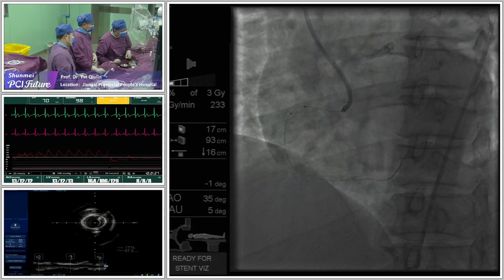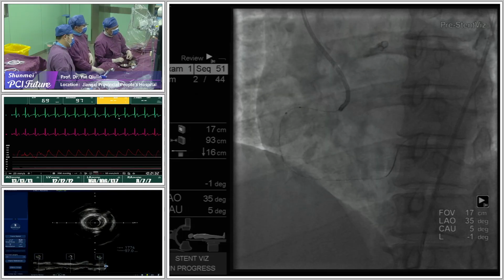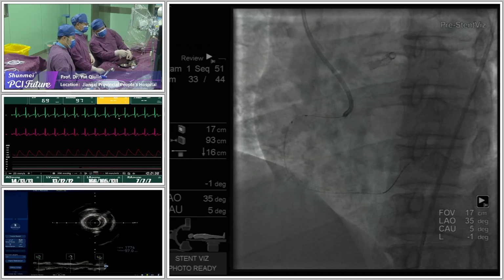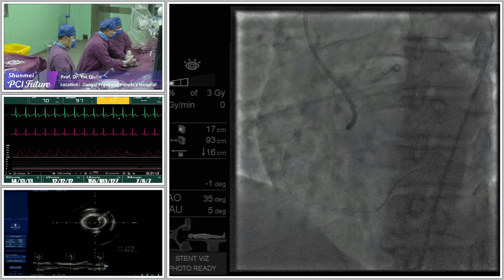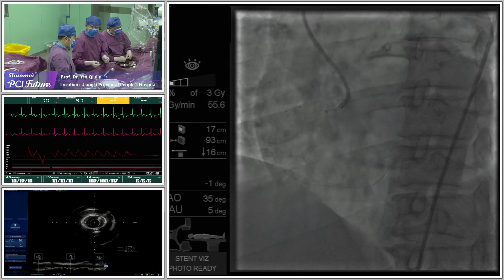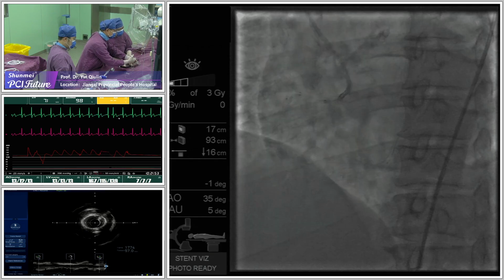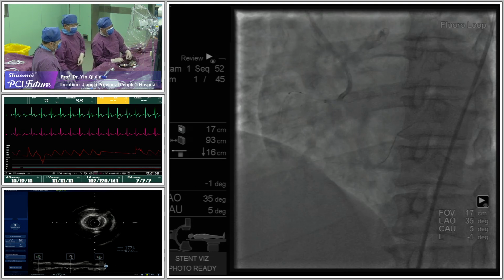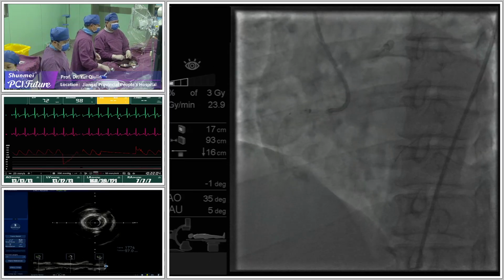Reviews. 就差不多这里了。我们做了体外化，对吧？We just leave here. Let us see the IVUS first. IVUS 能转播过去吗？Yeah, we can. Do you can see the IVUS? Yeah, we can see. Okay, the final angiogram.